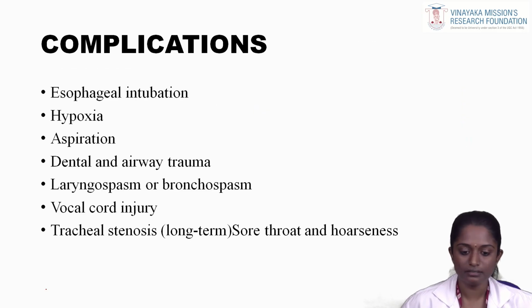Then complications. By using this ET tube, the complications that can come are esophageal intubation, hypoxemia, aspiration, dental and airway trauma, laryngospasm or bronchospasm, vocal cord injury, tracheal stenosis, sore throat and hoarseness.